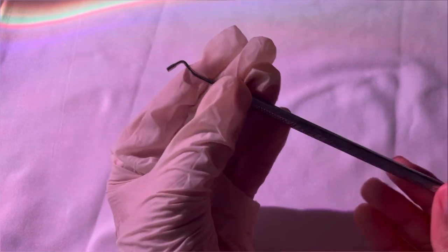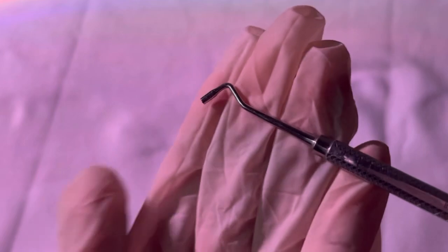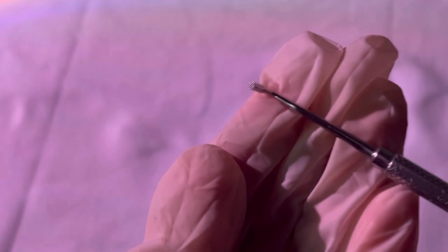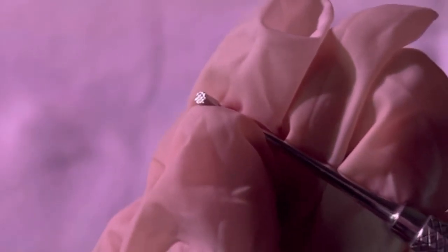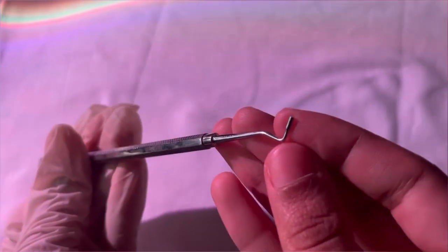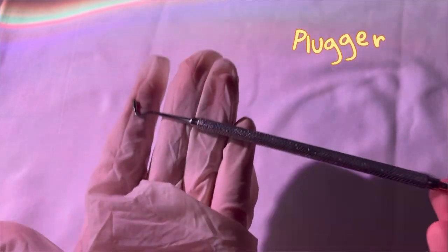I know you're all thinking everything looks the same, but trust me, it's not. The one I showed before was flat and thin, but look at this — it is not thin, it is slightly fat with a circular end. Everything is similar but this is a thinner version with distinct features. This instrument is known as a plugger.